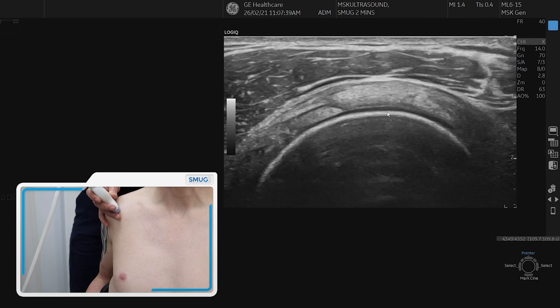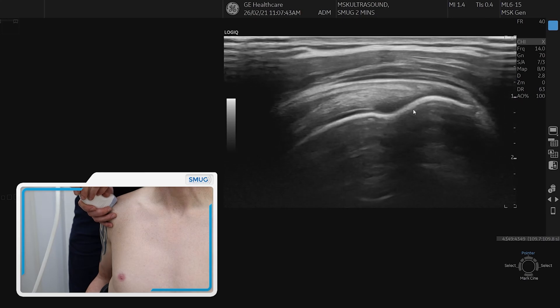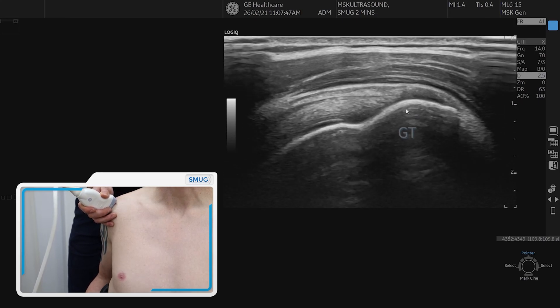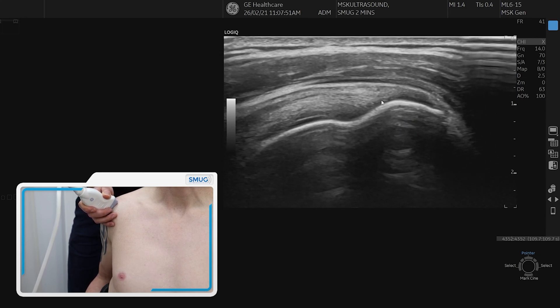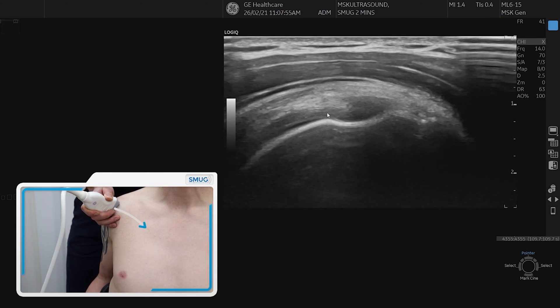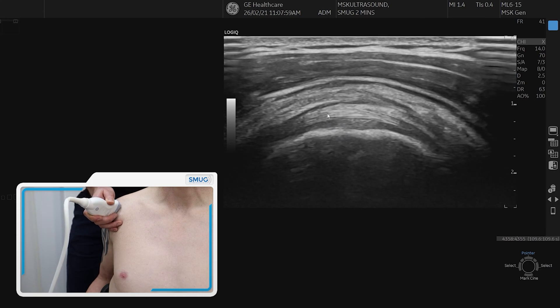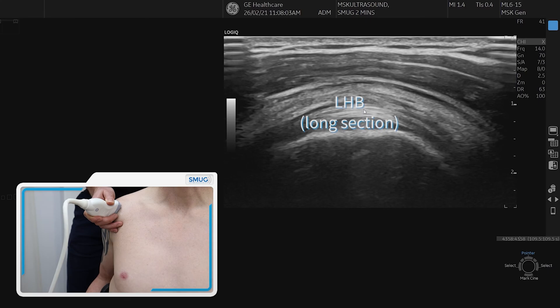To find a longitudinal section of supraspinatus, we simply spin on the tendon and bring the greater tuberosity into the middle of the screen. It's important to find out where we are on the tendon, and to do that we must push the probe forward until we go into the bicipital groove so the greater tuberosity falls away and the biceps comes in long section. That means we know that we're in long section.